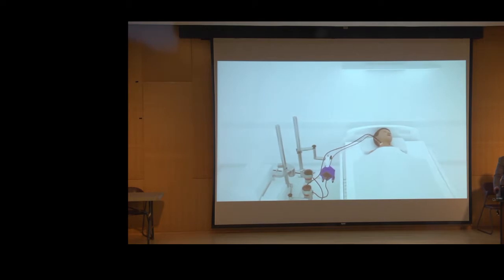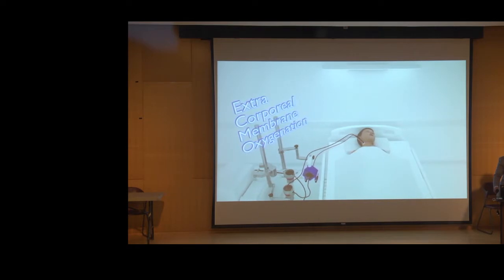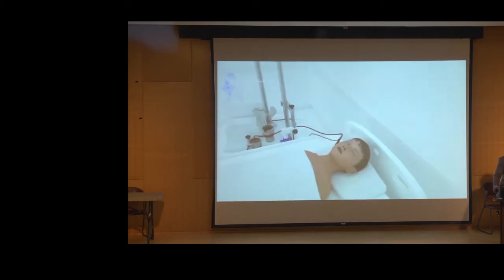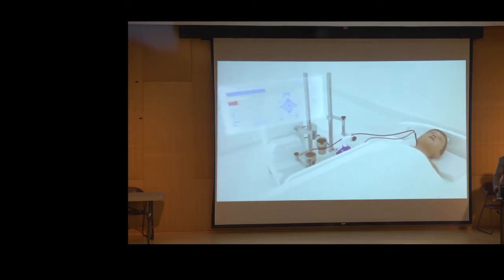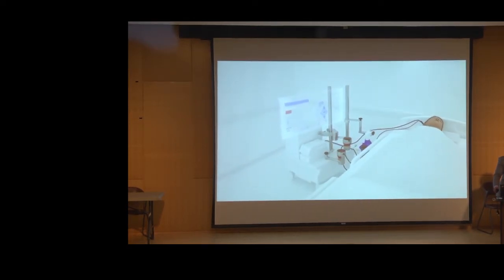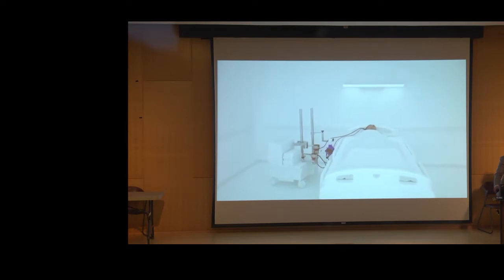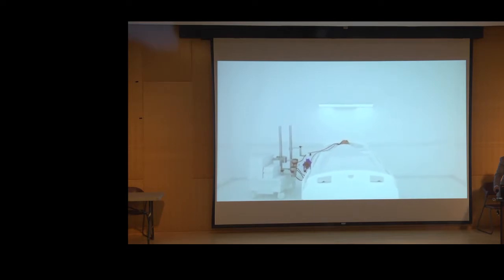ECMO stands for Extracorporeal Membrane Oxygenation, and it can carry out the work of a patient's lungs, heart, or entire cardiorespiratory system following trauma, infection, or surgery. It works by removing blood from the patient's body, pumping it through an artificial lung where it receives high concentrations of oxygen and carbon dioxide is removed before returning it back to the body. This technology sounds simple in concept. However, it is actually an intricate system that requires a team of specialists to watch over an ECMO response 24 hours per day, sometimes for several weeks.